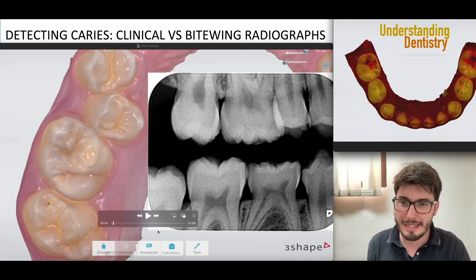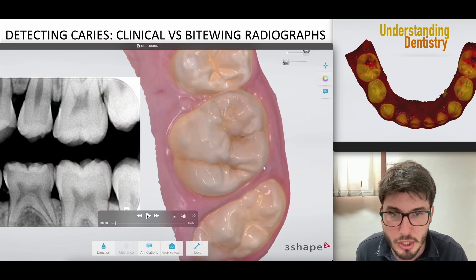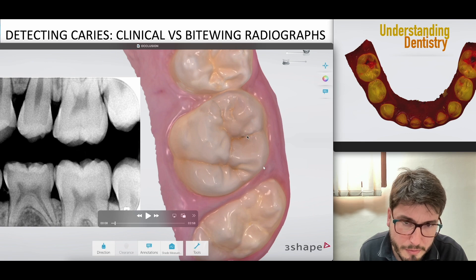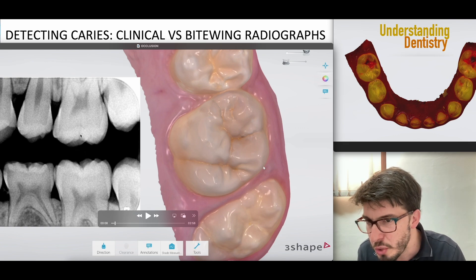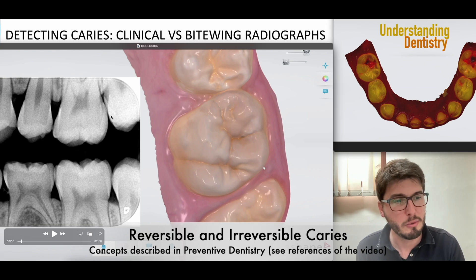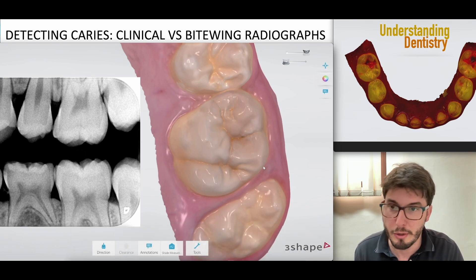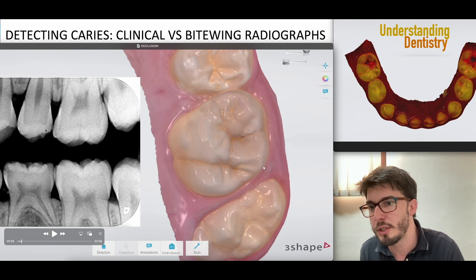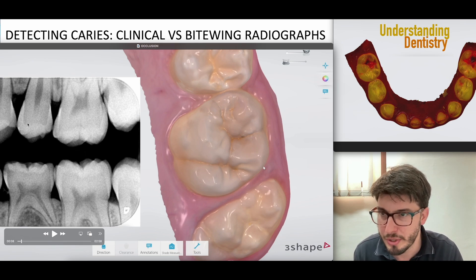Let's remove this reference and look at these lesions. Viewing the other side of the intraoral scan, we can see differences in brightness on the occlusal surface of the molar — there's even a dark spot in the fissure visible in the bitewings. This is still reversible caries; those are accepted concepts in preventive dentistry. We have alterations of the enamel: it is radiolucent but there is no dentine involvement, so these would be treated as initial lesions.